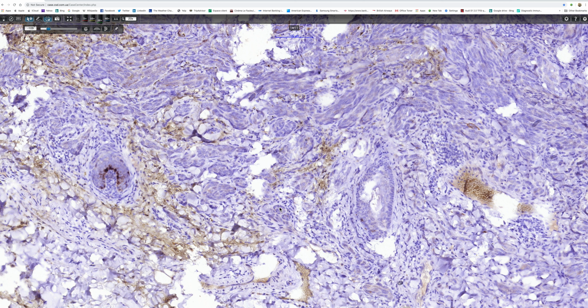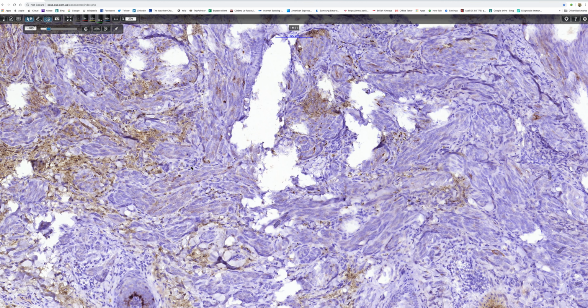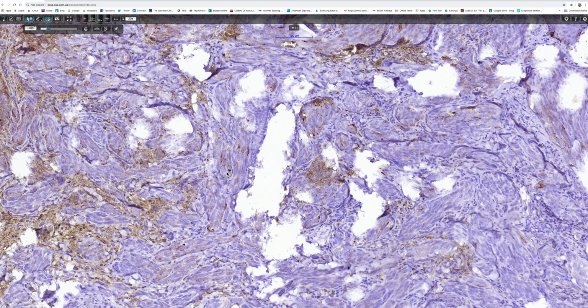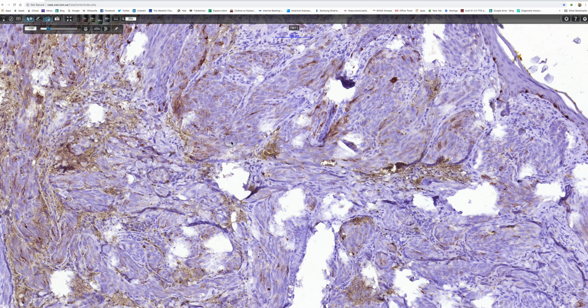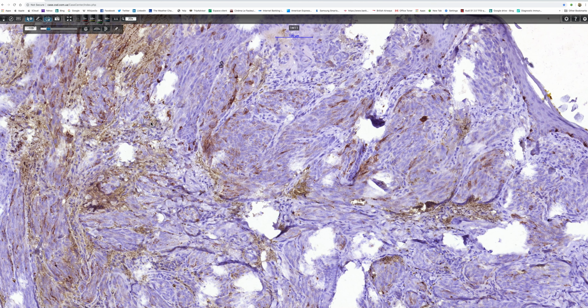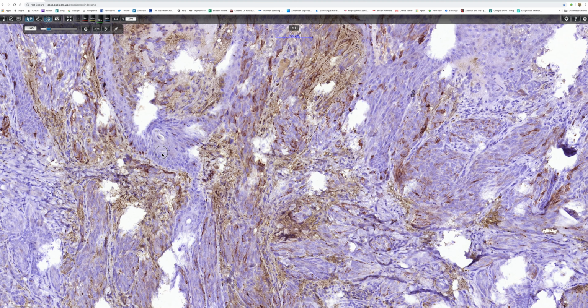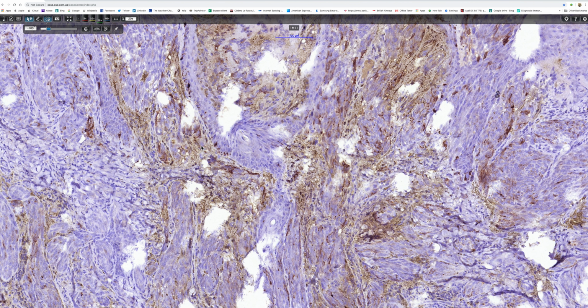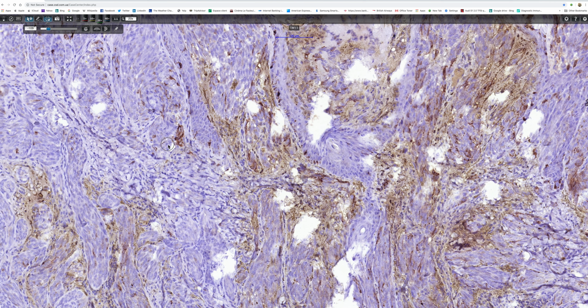So I think that should be enough to keep you going, and you may want to watch this video a couple of times because these are really two nice cases, and if you watch them carefully, I think you'll see all of the features you need to assess when you're looking at a Spitz nevus, and then you can compare these cases with one that you're worrying about.